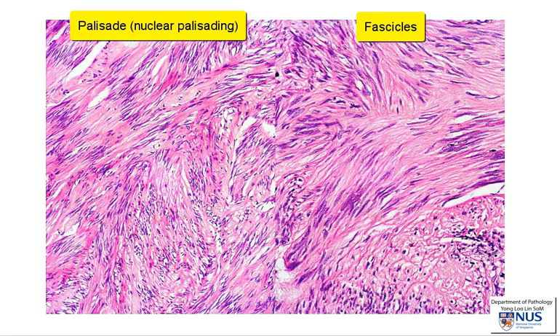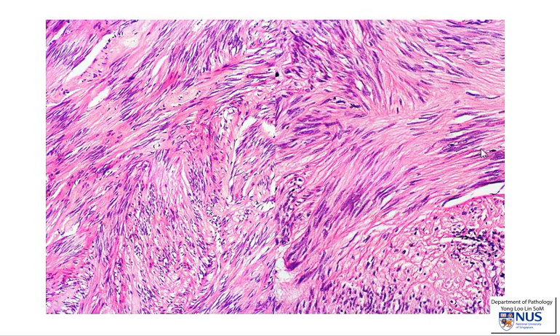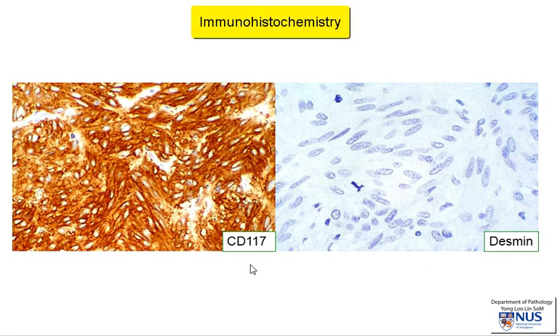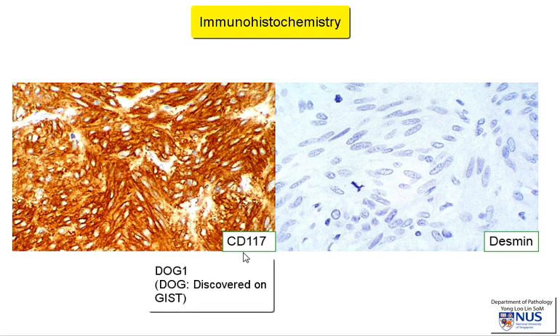Nuclear palisading can be seen in GISTs as well as schwannomas. Because these mesenchymal tumours can look fairly similar on microscopy, we do need some additional ancillary tests to tell them apart, and we employ immunohistochemistry for this. The two best and most specific markers for GISTs would be CD117 — you can see here it is very positive, with brown colour indicating a positive stain — and the other marker is DOG1, which is also very accurate, very sensitive, and rather specific for GISTs.